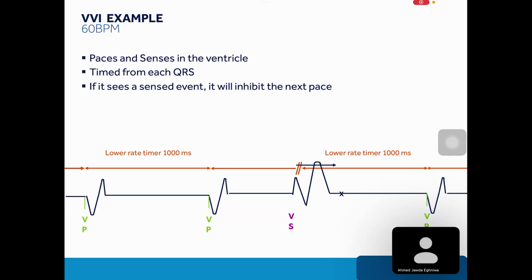So here there is a single chamber pacemaker that paces in the ventricle and senses in the ventricle.